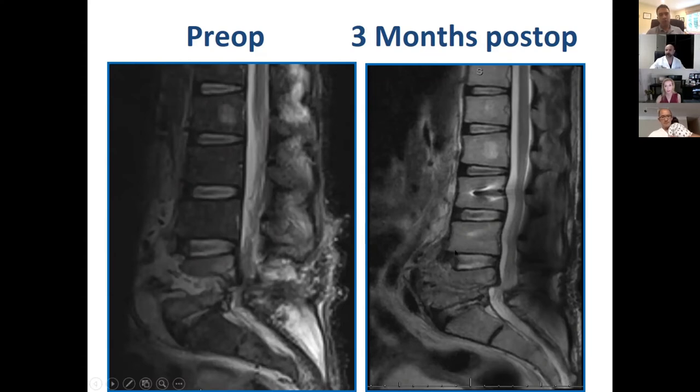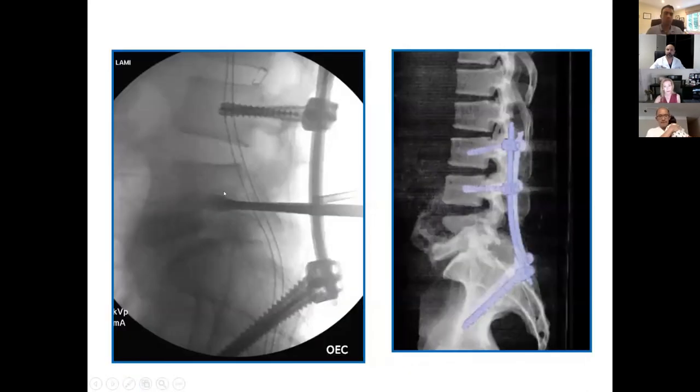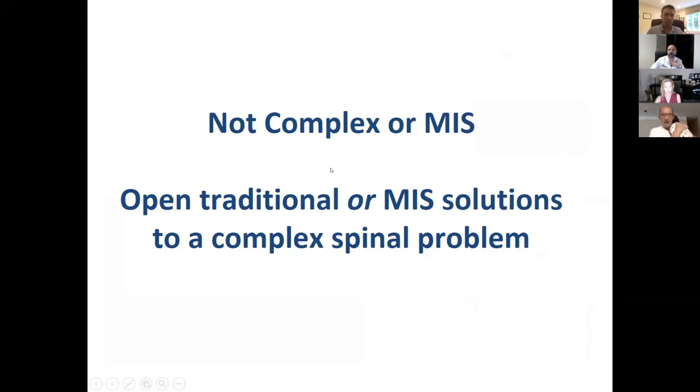Do you think this was more of a Charcot joint, or just a real chronic osteomyelitis? I think this was osteodiscitis. We had a lot of pus come out. When we put that big curette there to debride that area, we actually suctioned out purulent material through that TLIF incision, believe it or not. So it's good to use different skill sets. So again, this is a big Ali.